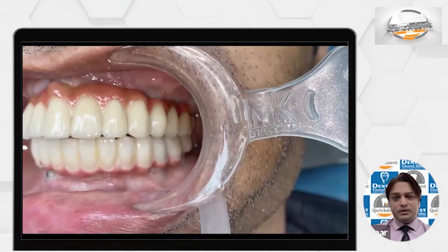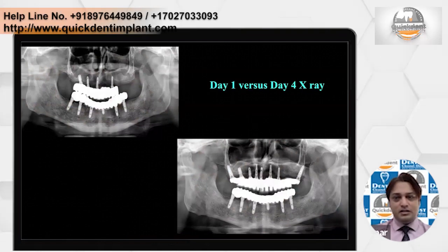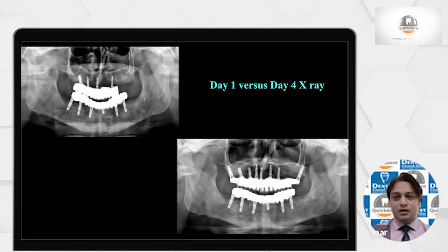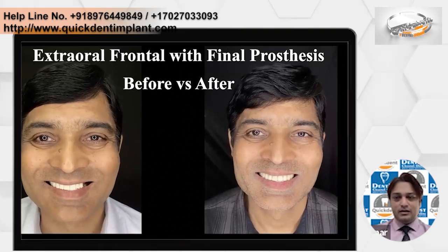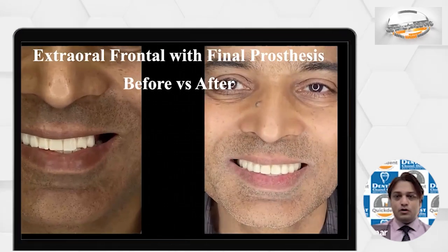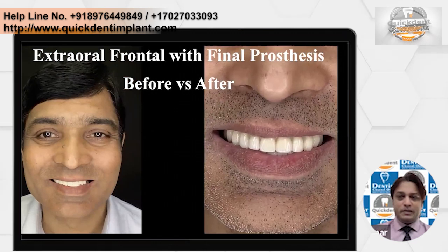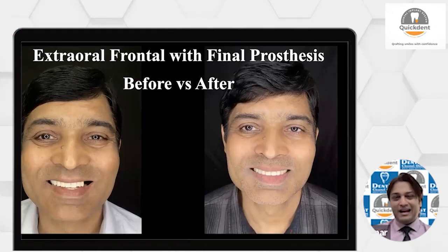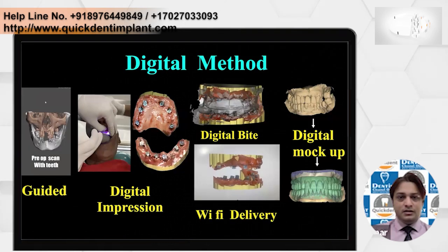He was very happy, because he got the posterior teeth. Initially, you can see, I think 2 teeth on the left hand side were giving him more advantage over the previous prosthesis. And this is the patient with the fractured teeth, and after receiving the final prosthesis. He wanted something more curvy teeth. Whereas pre-operatively it was a zirconia, but it was all flat teeth. So all these requirements were taken into consideration.